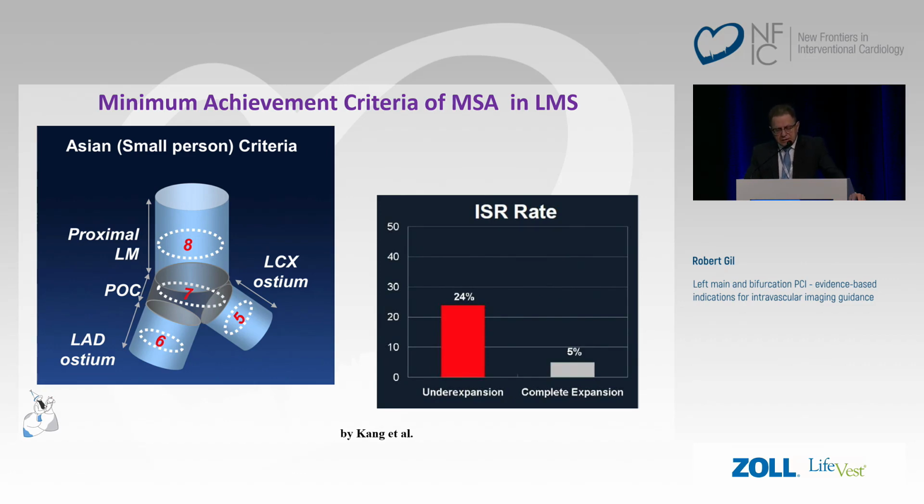It translates into the final and late outcome of the patients, because underexpansion of the stent makes a very big difference.